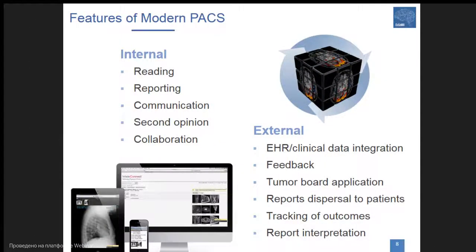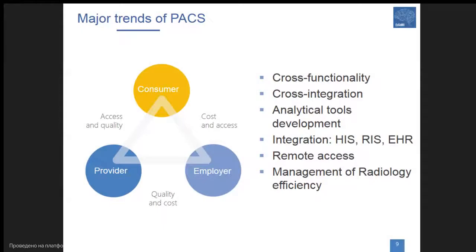The modern PACS should allow reading, reporting, communication, second opinion, and collaboration of colleagues. And externally, it should be integratable with clinical scenarios and workflow. It should allow feedback from the clinicians. It should have tumor board applications, and it should allow tracking of outcomes. So very close integration of PACS with clinical information systems is very, very important. And I will say some words on why this is so.